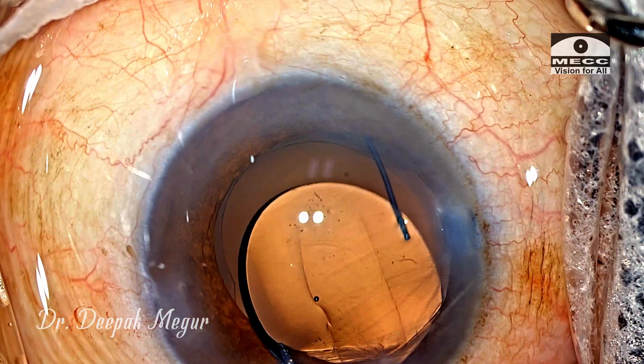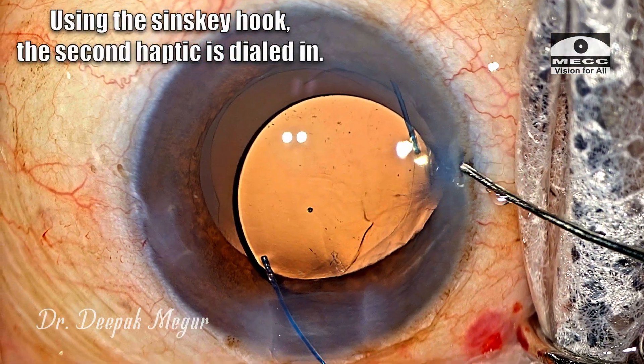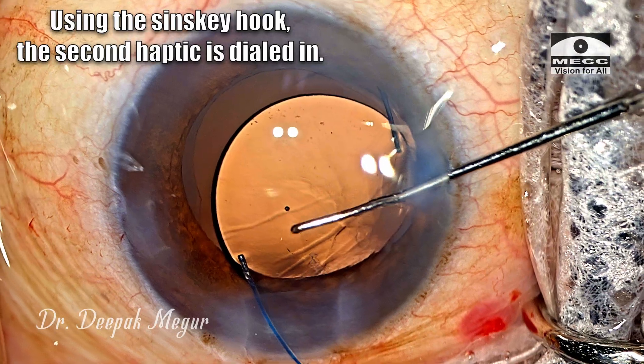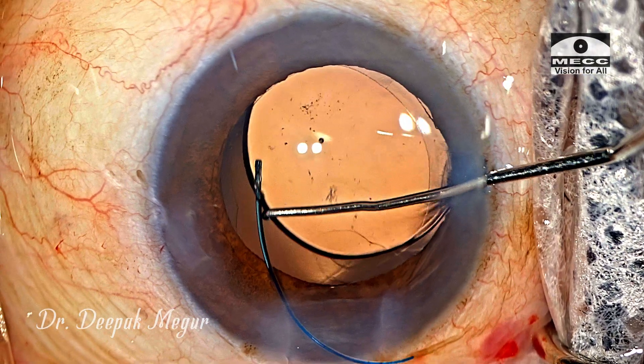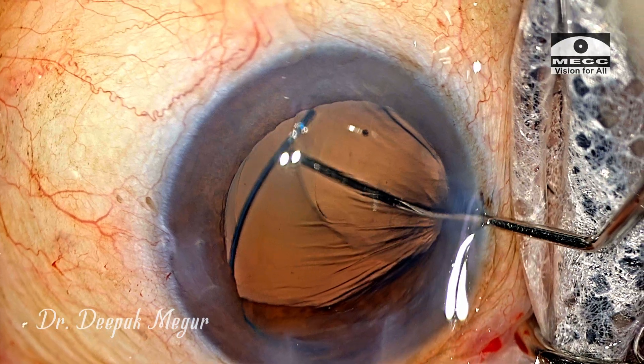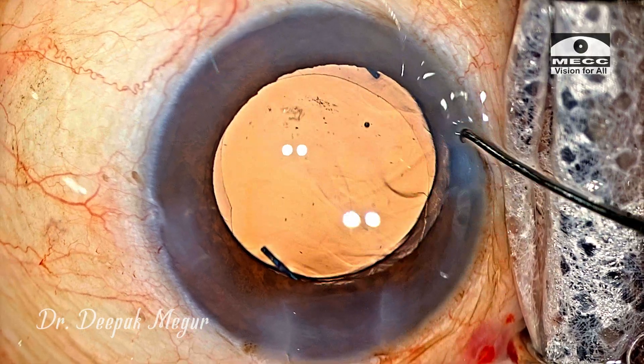At this point it is a good idea to refill the chamber with OVD. In this case I'm continuing without it as I felt the chamber was all right. Then using a Sinski hook the trailing haptic is gently dialed into the capsular bag. Alternatively, you can use forceps to guide the trailing haptic into the bag.